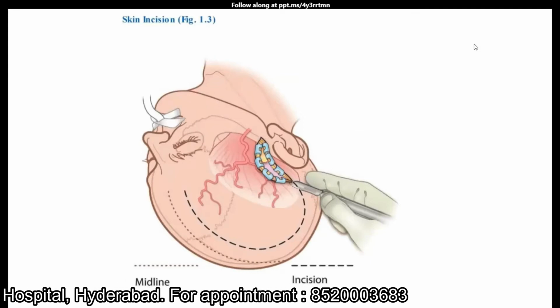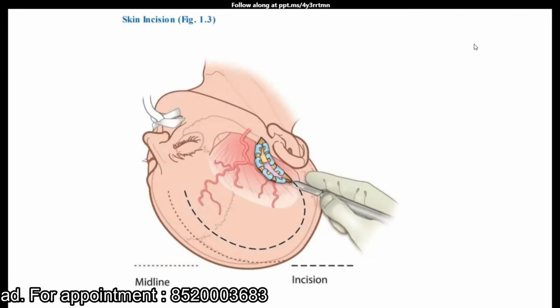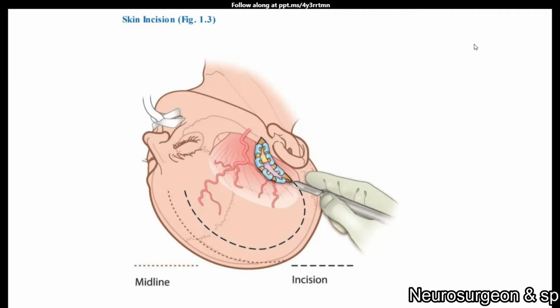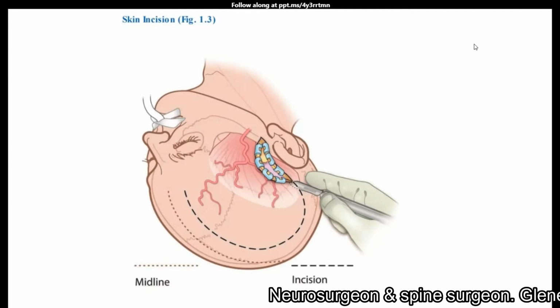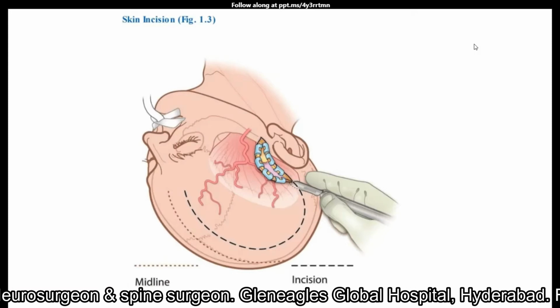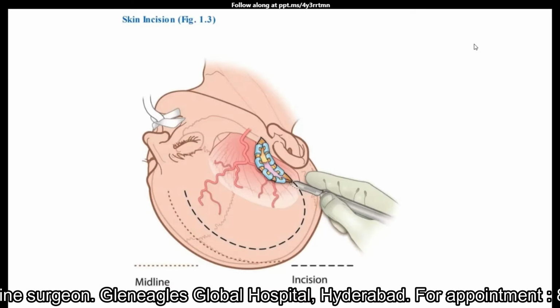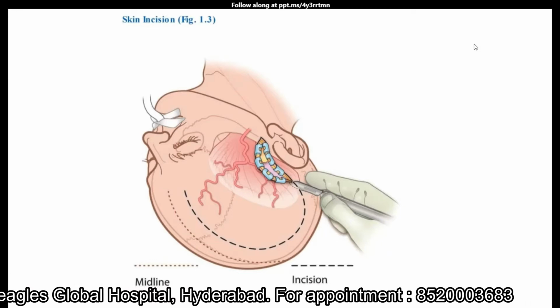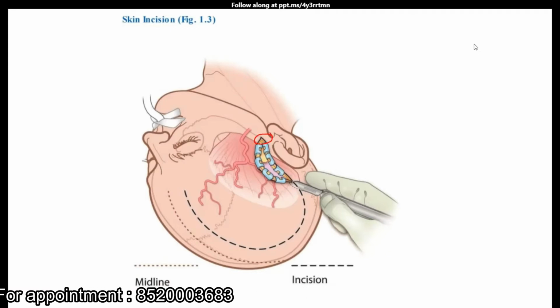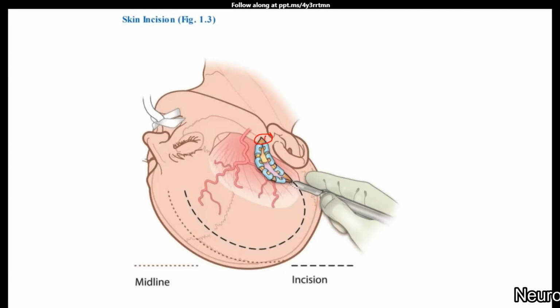Coming to the skin incision, for a large frontotemporoparietal acute subdural hematoma, the classical skin flap which is usually taken is a Falconer incision or the reverse question-shaped flap. The flap starts in front of the tragus above the zygomatic arch. So this is a starting point. Then it takes the shape of a reverse question mark. That is, it rises superiorly towards the vertex.